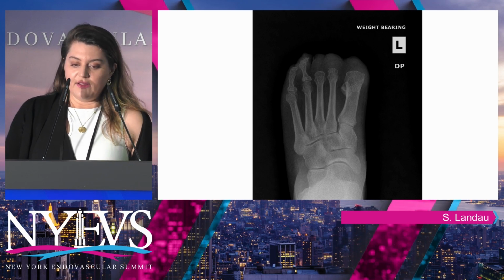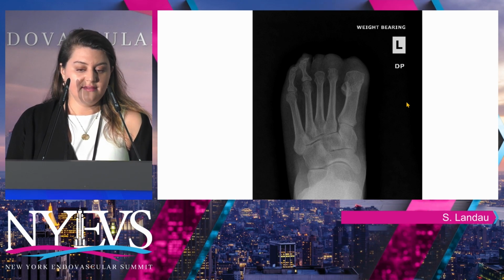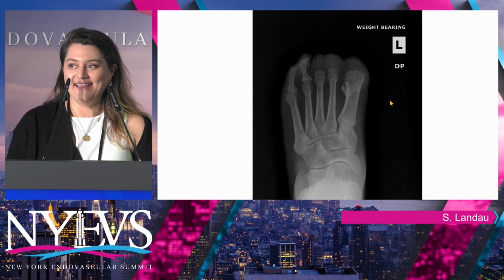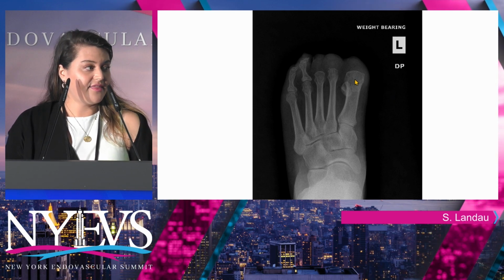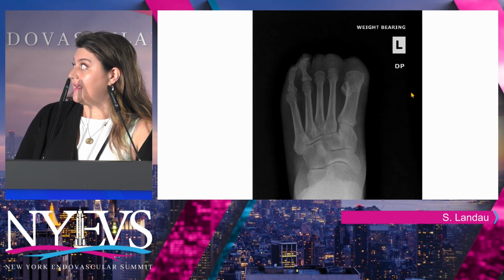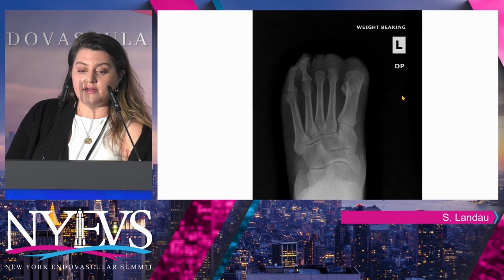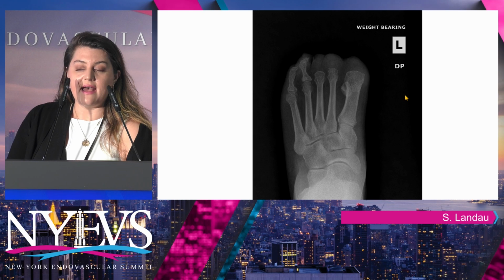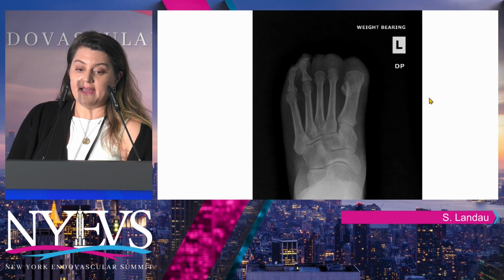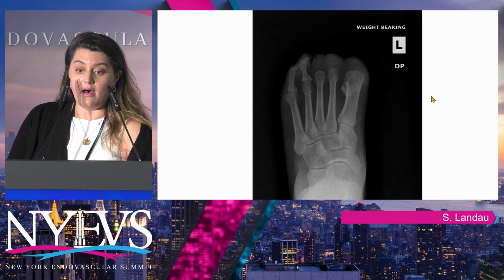So this is his radiograph for the students. It's not a transmetatarsal amputation, like they always say. It's hallux, second and third digital disarticulations at the MPJ. So the metatarsal heads are still intact, and that's why he does have a lot of peak pressures there, because mechanically he's still trying to toe off.